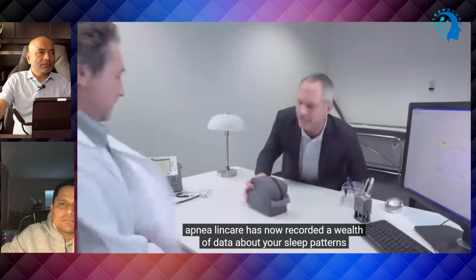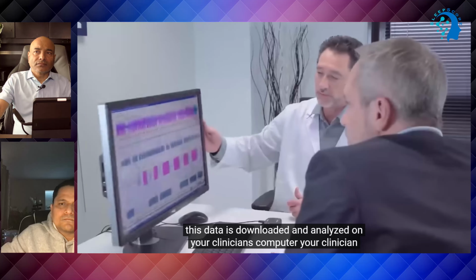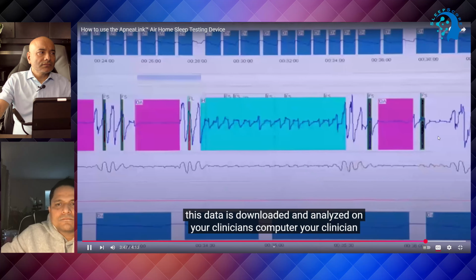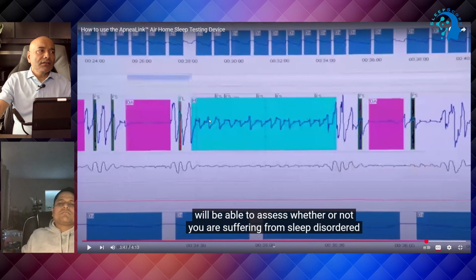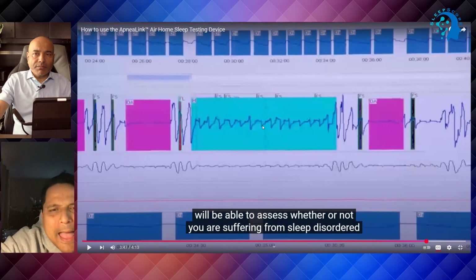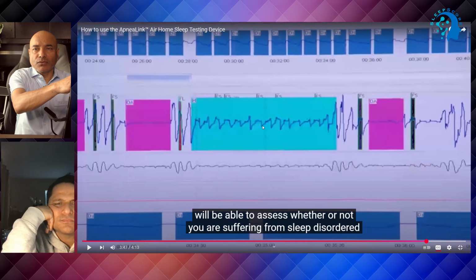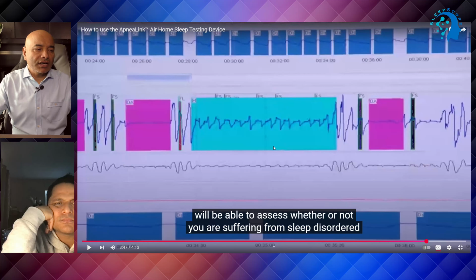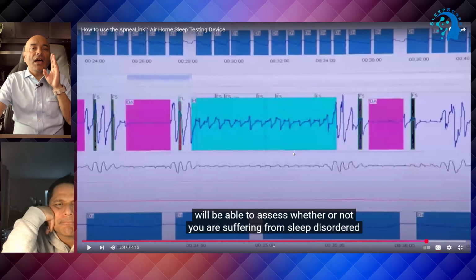The Apnea Link Air has now recorded a wealth of data about your sleep patterns. This data is downloaded and analyzed on your clinician's computer. See, this way, this is the data. This is the report of the sleep test. Now here, this blue is hypopnea. Okay, blue is hypopnea. So I know you have questions about what is hypopnea, what is apnea. Just remember these terms: hypopnea, apnea, and other things like snore.